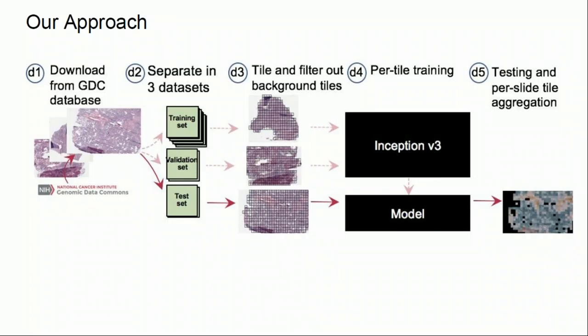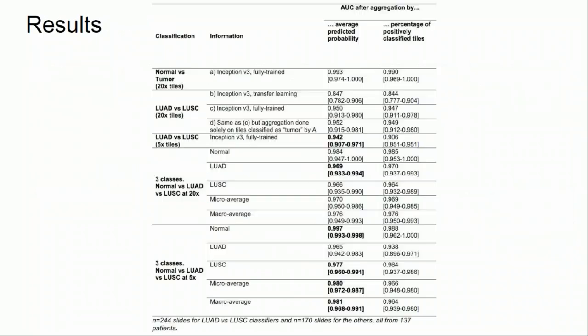That's all we use for this work, and we evaluated on our data. What we tried is a very simple architecture, Inception. That was our starting architecture. We look at this slide, which is a tumor cut under the microscope, as an input, and the output is what the mutations are and what the subtypes of the cancer are.